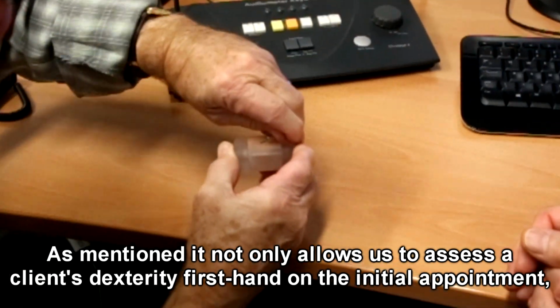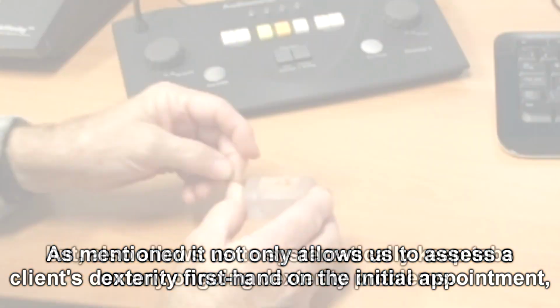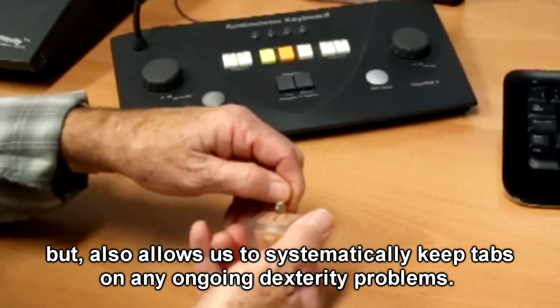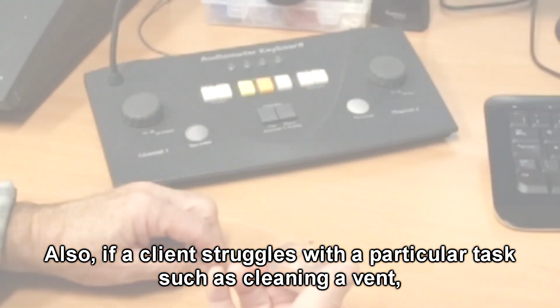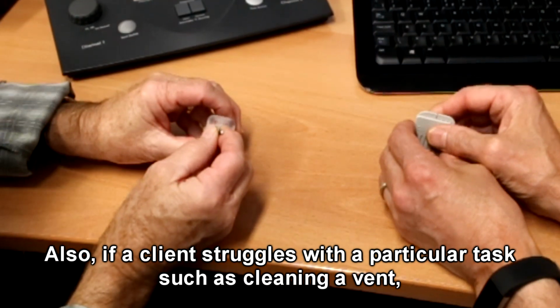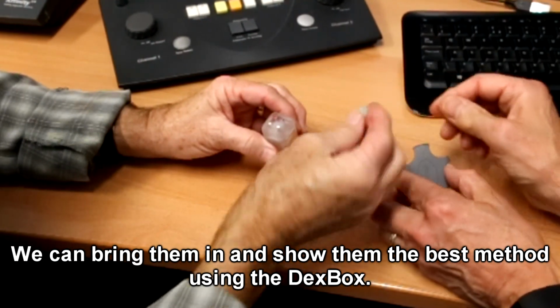As mentioned, it not only allows us to assess a client's dexterity firsthand on the initial appointment, but also allows us to systematically keep tabs on any ongoing dexterity problems. Also, if a client struggles with a particular task such as cleaning a vent, we can bring them in and show them the best method using the DexBox.